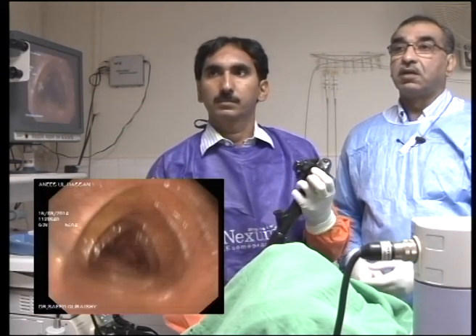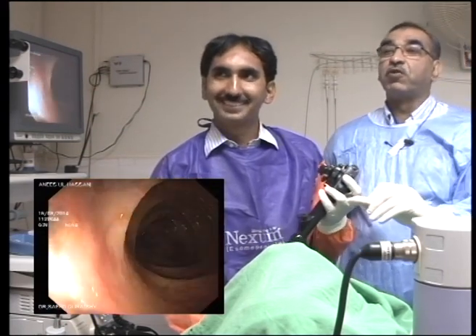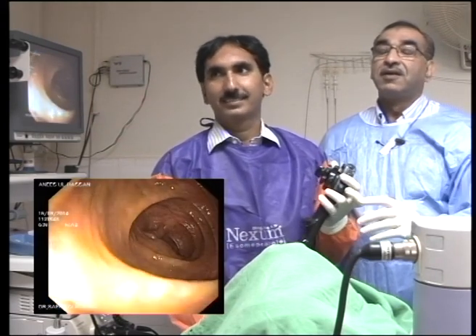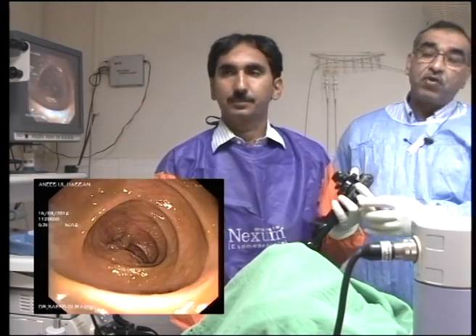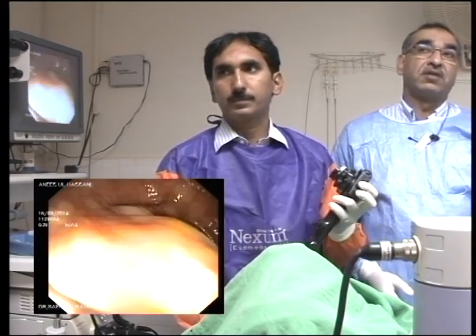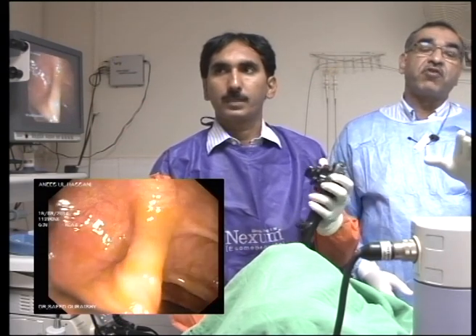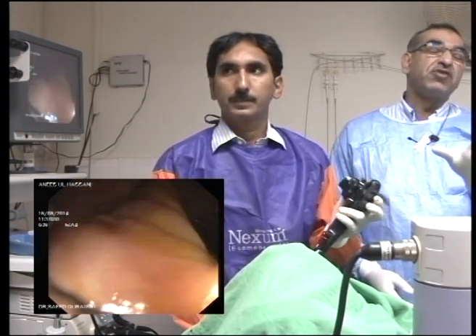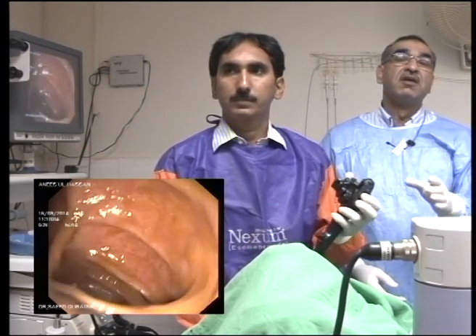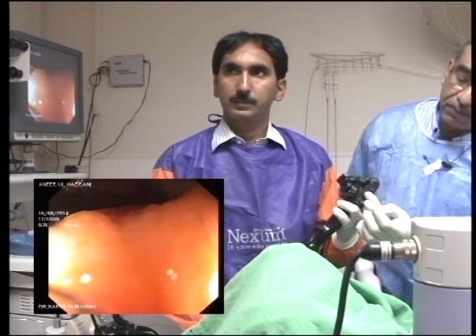So you now take your finger off. Waqar, I'll hold your finger. Once you've done this, explain to us why did you use the stiffener? It is just to give you more support. It gives you a bit of body in the sigmoid colon. It stops the scope from looping in the sigmoid. Normally it shouldn't happen. With good technique, I normally don't use the stiffener as a routine. But for beginners, I always advise it to help them.